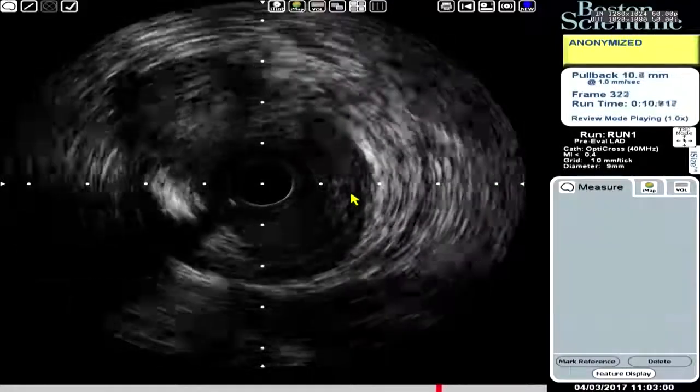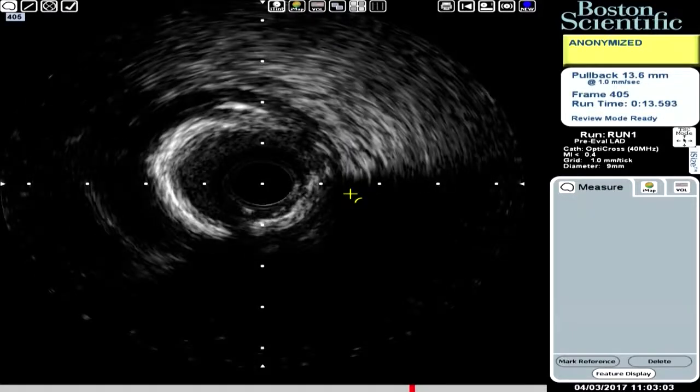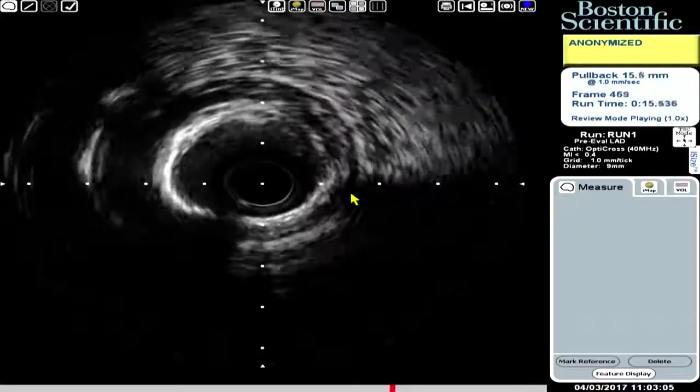I can see Ashok also sitting there. Yes, Mathew. I just came up and missed some of it. Yeah, Ashok. No, I said I missed some of it, so I'm not clear about the history, but this is circumferential calcification. No, make it very simple.